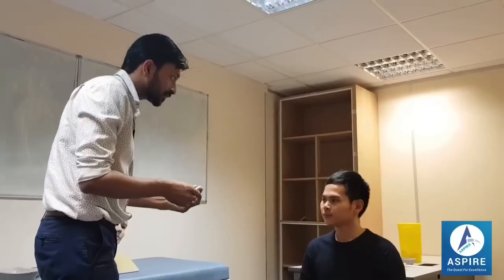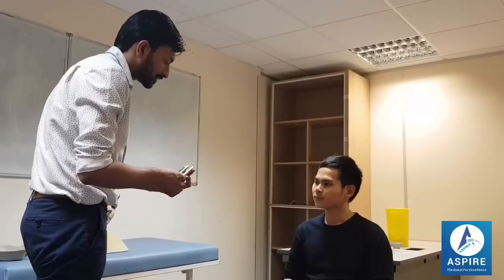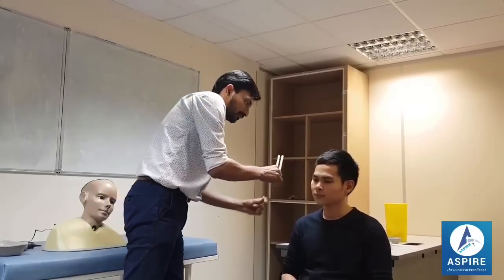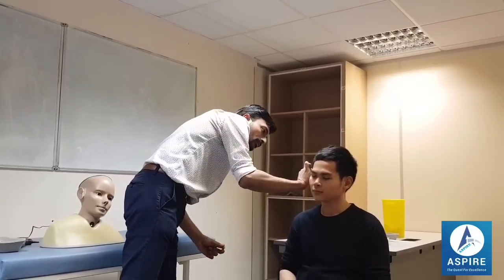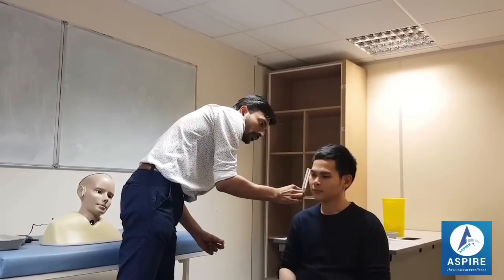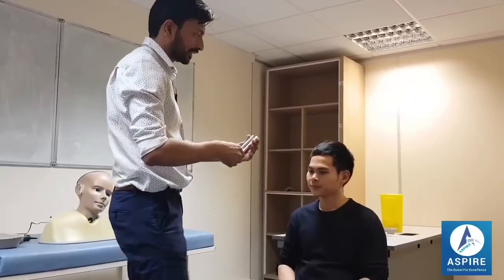This is a tuning fork. I will buzz it and place it in front of your ear and at the back of your ear. You have to tell me where you can hear better — in the front or at the back. The patient reports hearing better at the front. I'll be doing the same in the other ear.